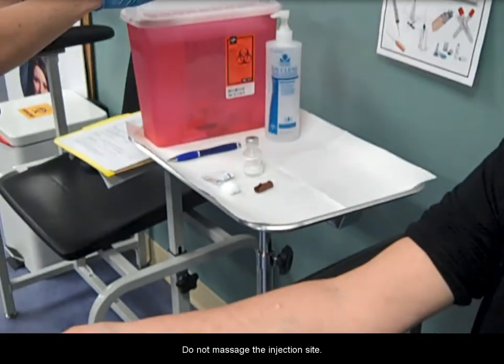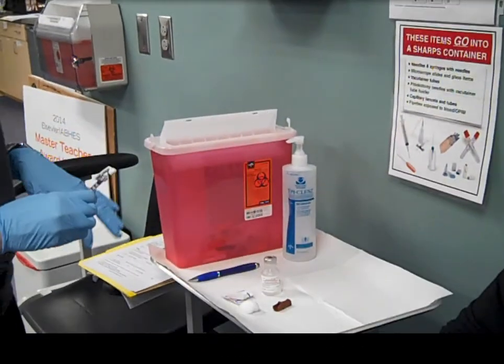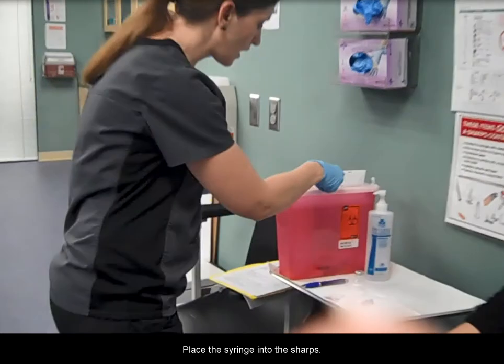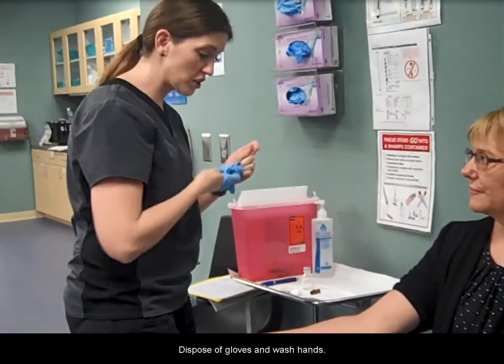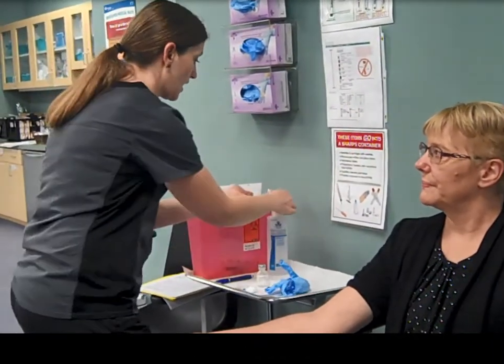Remove the needle by the same angle of injection and apply the safety. Do not massage the injection site. Place the syringe into the sharps. Dispose of gloves and wash hands.